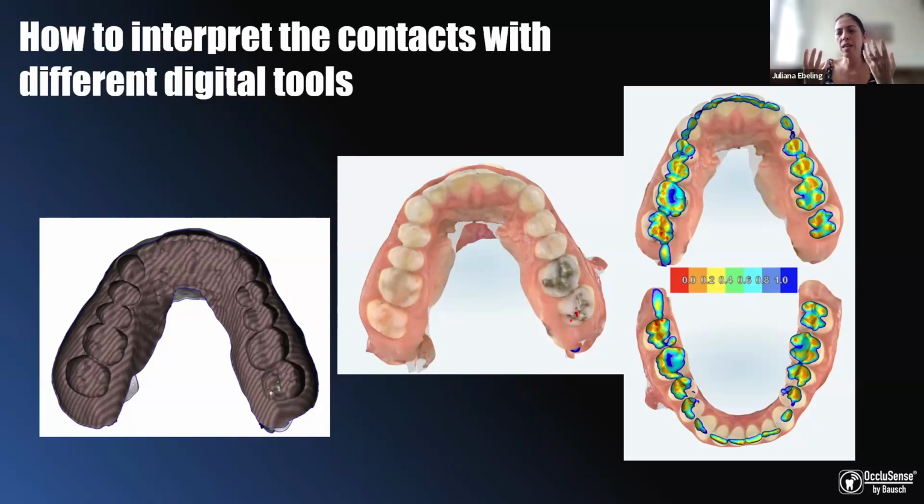The literature says that normally we have a contact, but when we put force, the ligaments absorb this force, and the muscle activity contracts and then puts these teeth in contact. But the teeth in reality have no crossing between them.